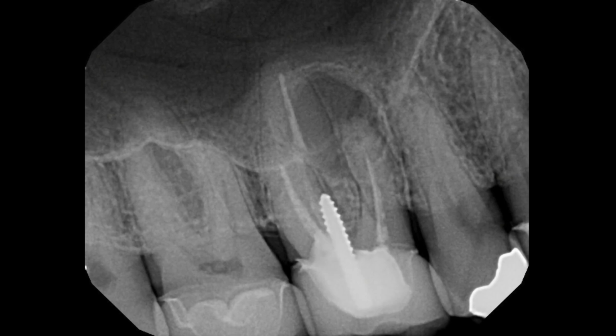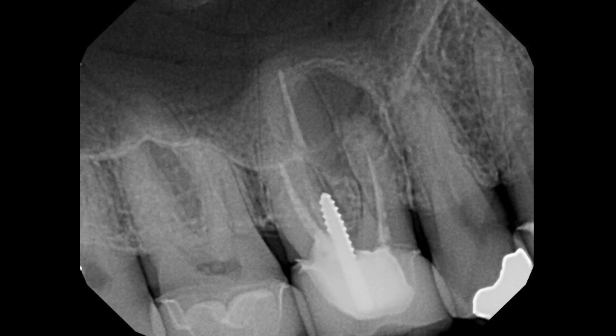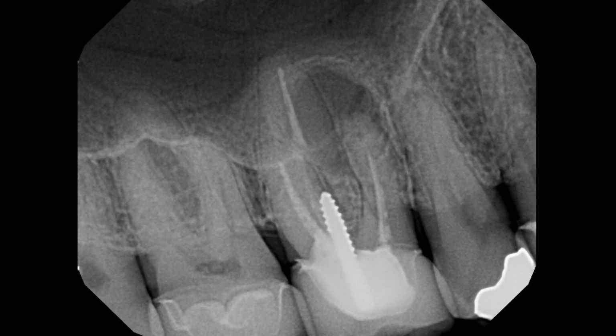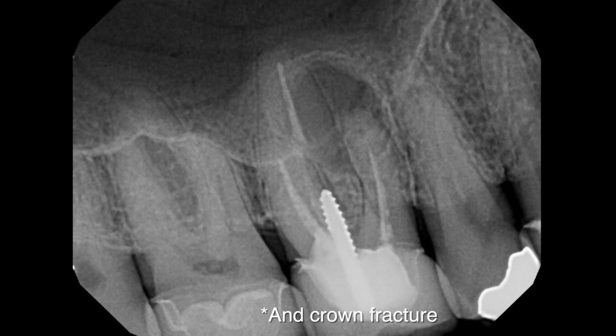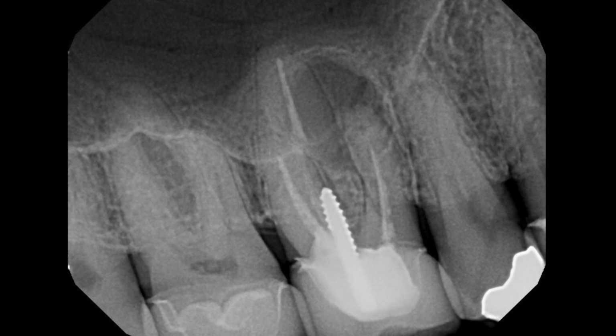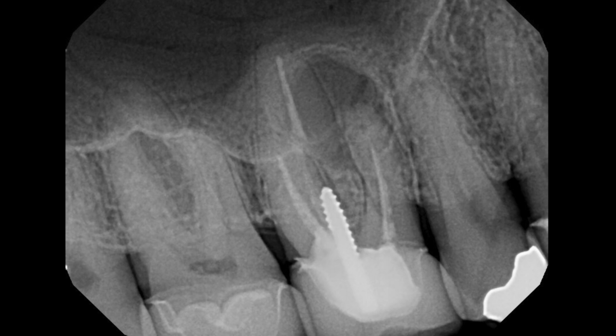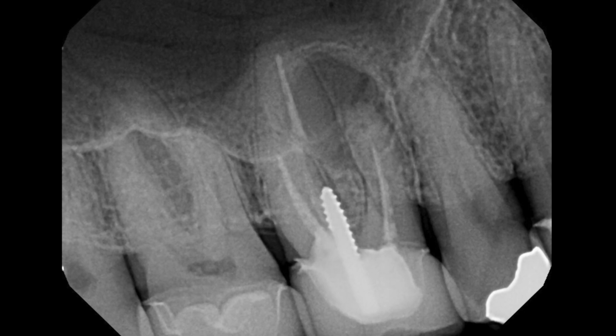But right now, by attempting to remove all of the posts and the canals, root canal fillings and the other canals, we expose this patient to additional risk of root fracture from removing these screw posts in this tooth, as well as other problems, whereas the CT, as you saw, did not show any additional lesions associated with the distal buccal or the palatal root, and therefore it seems to me to be unnecessary at this time. We can always do that in the future.